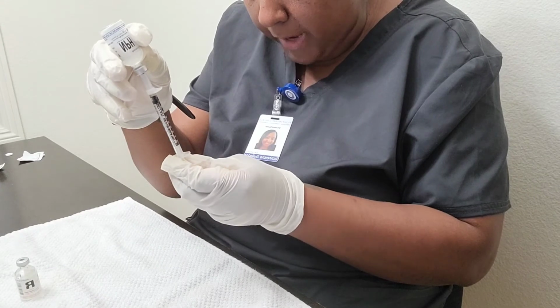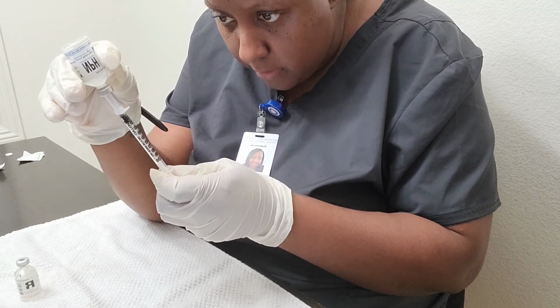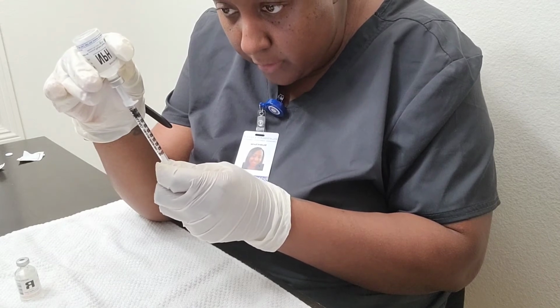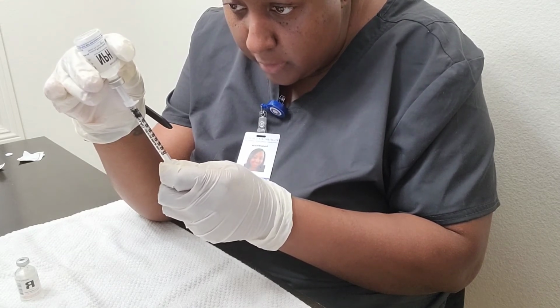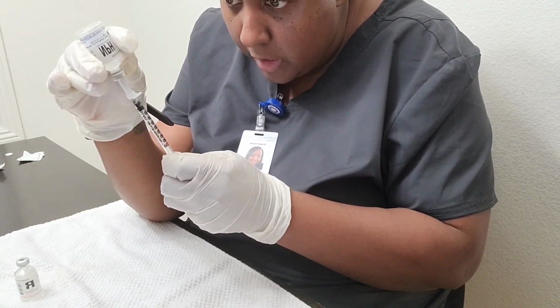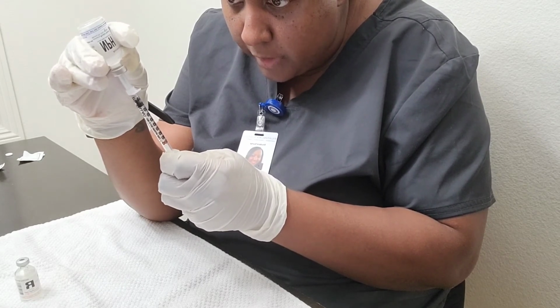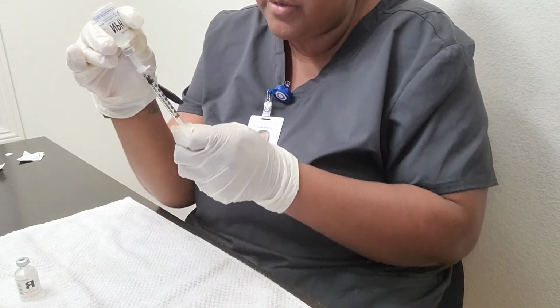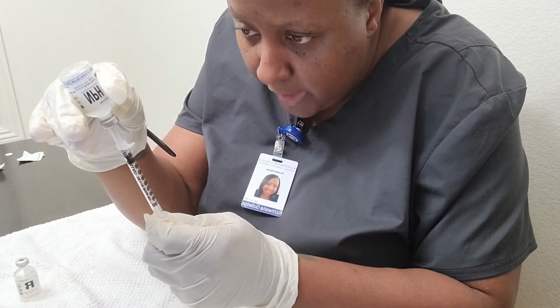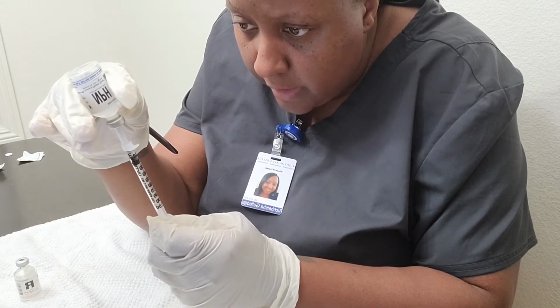And we're going to pull back 8 units of the NPH, which is going to be a total of 12 units. Our dose is going to be 12. So we pulled back 8 units of NPH, the intermediate.